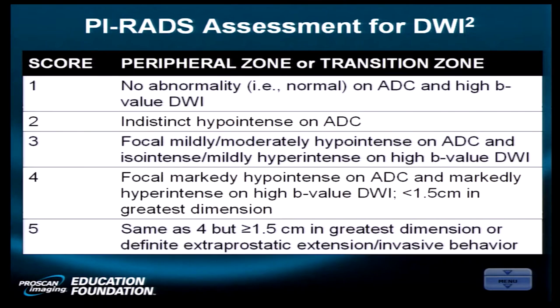Third reason, viscosity. Where is that demonstrated? In two examples you know about from your experience in neuroradiology: abscess, epidermoid. So that's easy. If you get something really viscous in the prostate gland, really thick, then you could be in a situation where there is diffusion restriction. And a prostate abscess would be just that scenario. So let's take the situation where we have a PI-RADS 1 designation just for DWI.